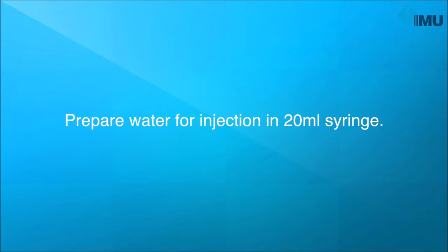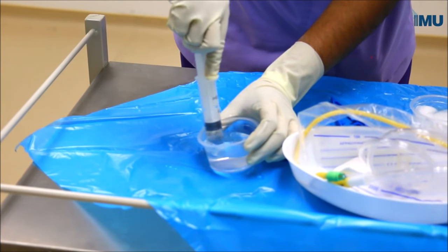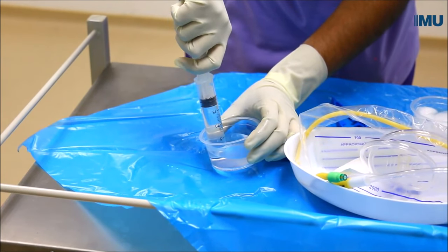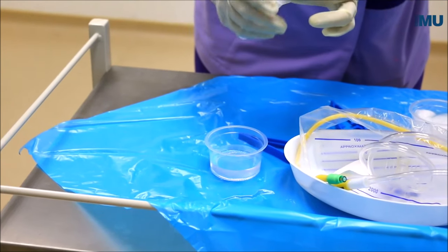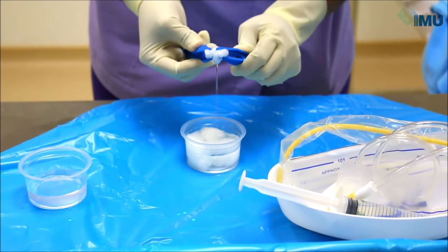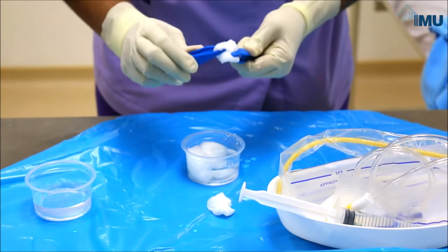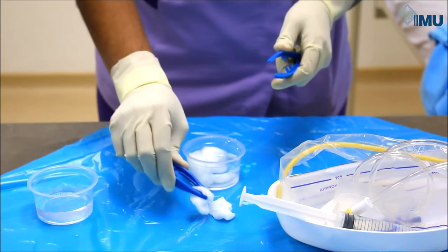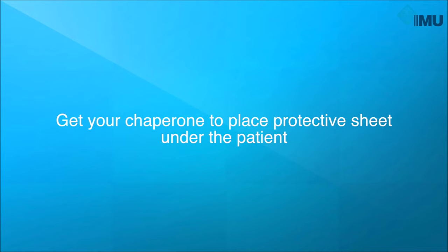Connect the tip of the catheter to the urine bag and place it in a kidney dish. Prepare water for injection in the 20ml syringe. Prepare the cotton swabs for cleaning. Position the patient with her thighs apart and knees flexed. Get your chaperone to place the protective sheet under the patient.